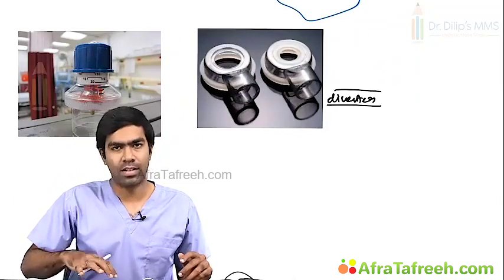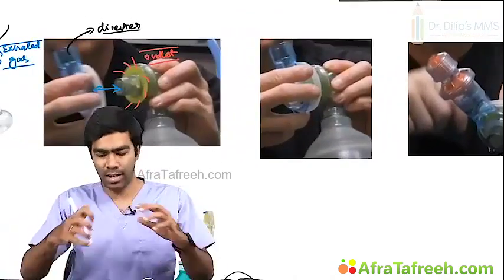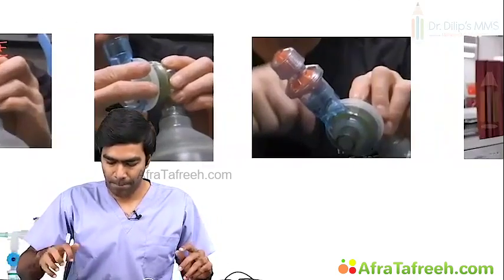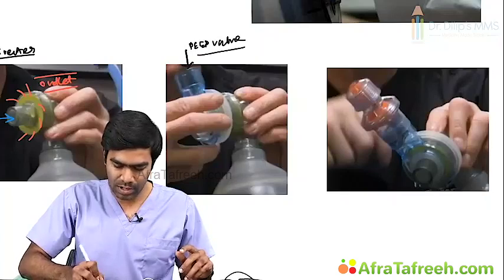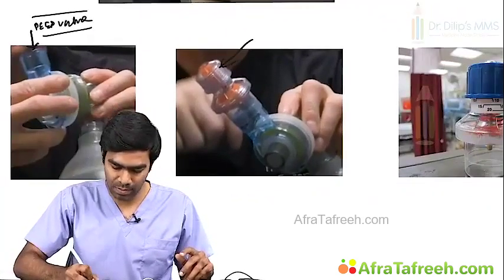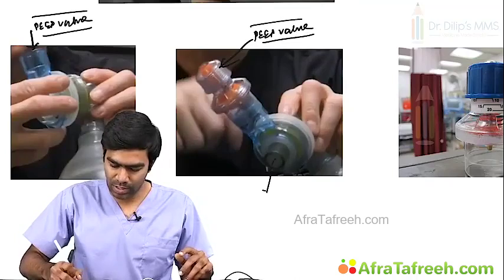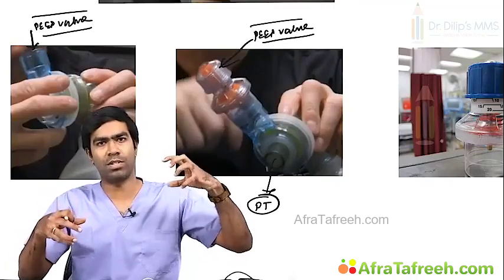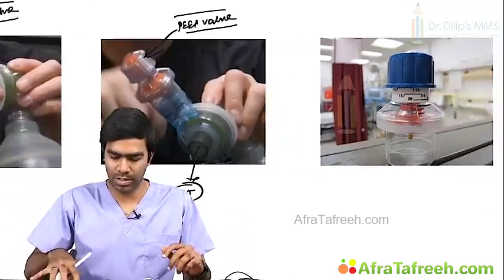This is a diverter, and you have to attach this diverter to the outlet area. Attach the diverter. So once this diverter is attached, now in this area you can attach the PEEP valve. In this area you can attach the PEEP valve. So this is the PEEP valve. You can attach the PEEP valve now, and this you can connect to the patient end. So when he is exhaling, this PEEP valve will capture some of the pressure, and it will generate a positive end expiratory pressure. So that's it.